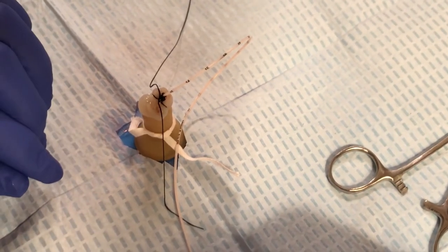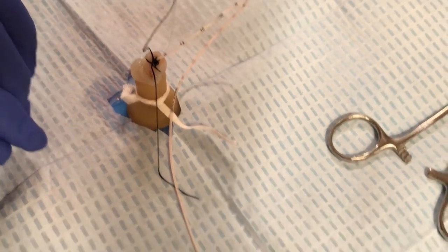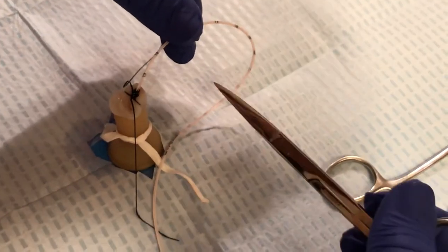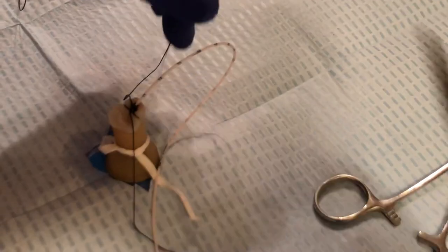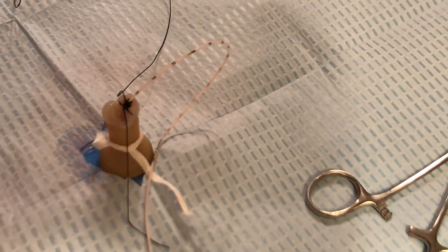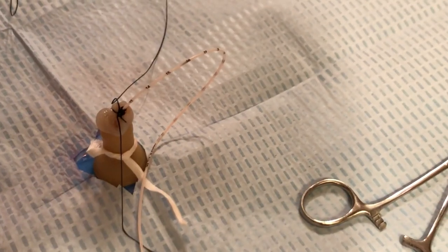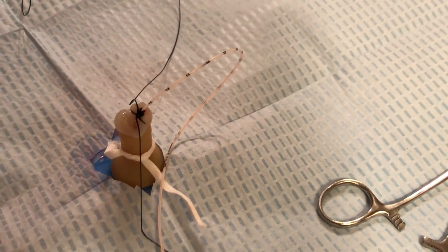We want to communicate to the nurse the exact location of the suture marking. For this particular baby, we would let the nurse know the umbilical cord is sutured at the 12-centimeter marking — important for documentation. Also important that any manipulation of the catheter and its end destination are documented as well.